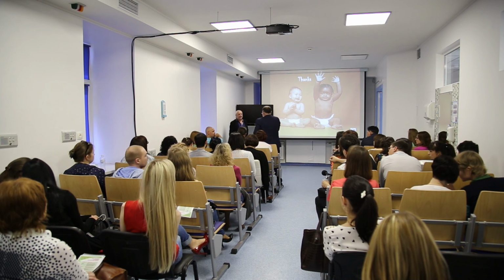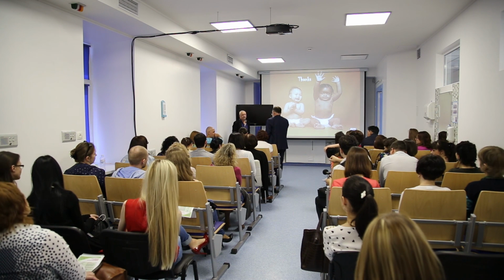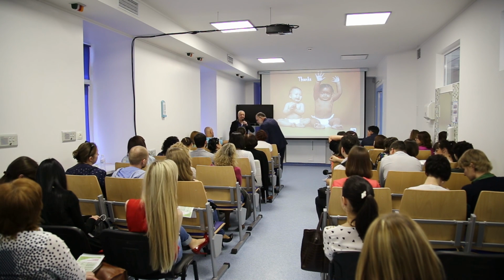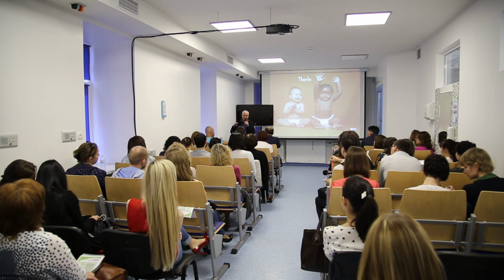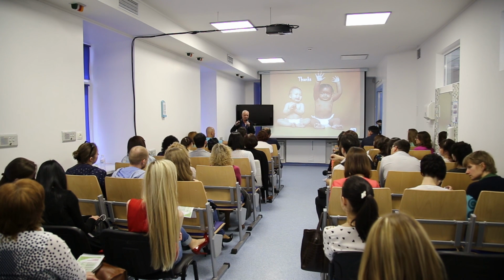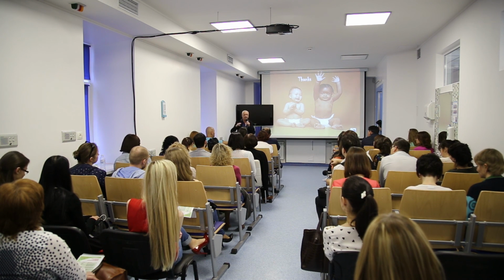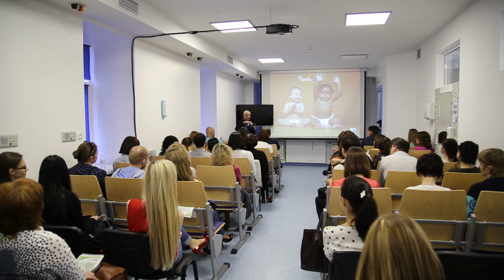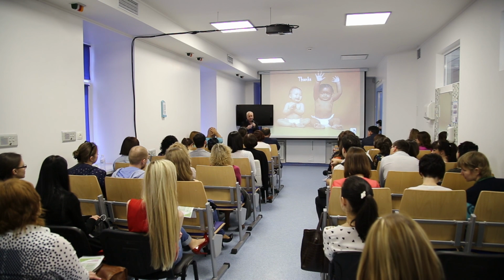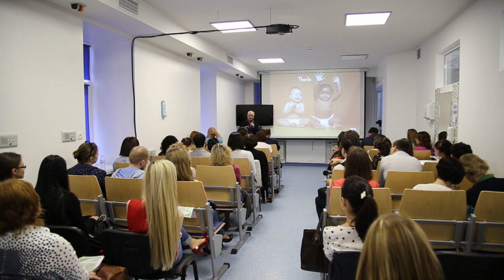With your permission, I would like to ask you one practical question. What is the minimal sperm count when you could make IMSI? We can go down to 5,000, but more than the number, the motility is more important than the numbers. Because if you have 5,000 and you put the sperm in the drop of PVP, and you have good motility, you can go out and catch them. But if the motility is very low, you can do nothing.